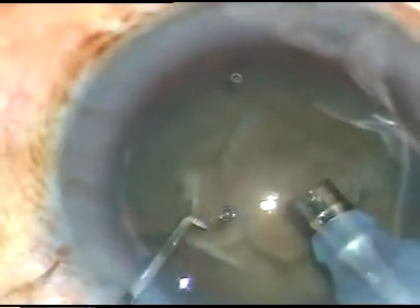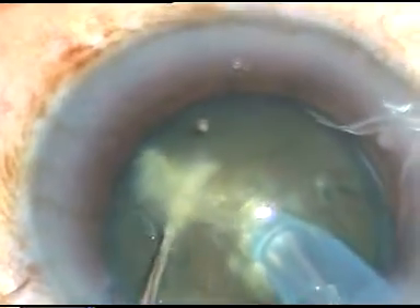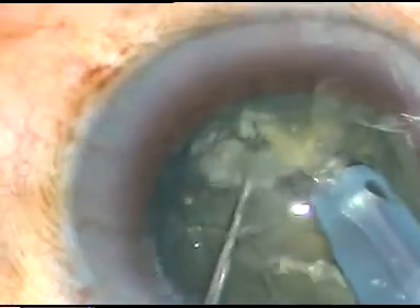Now we have to enter into the eye with the tip of the phaco handpiece. Viscoelastic substance has been injected into the chamber. The tip of the phaco handpiece will be impaled into the nucleus just near the equator. Push the nucleus downward a little bit and start from one equator. The tip is not visible — just going to the other side and the nucleus is divided. This is an excellent technique where you need not sculpt at all. We just cross the center, go near the other equator, and use the chopper. See this chopper — it's such a small chopper and it is doing a beautiful job.